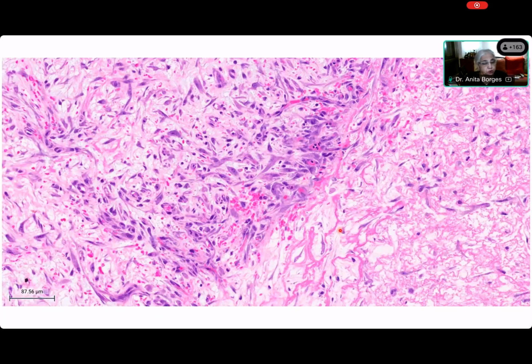And what is the cellular tissue made up of, Elsa? What is the principal cell that you are seeing over here? Ma'am, the stellate cells. Yes, absolutely. The stellate cell, that is the principal cell that you're seeing over here. So we have a lesion in which you have mainly stellate cells and very few spindle cells.